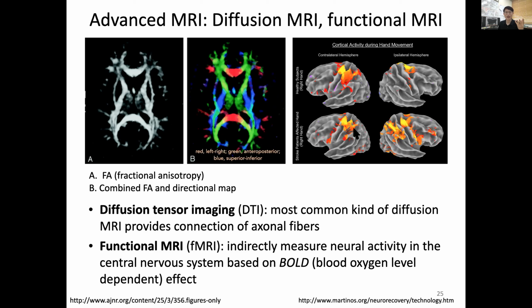So when you perform fMRI, it's not going to be just one time. It's going to be more like on, off, repeated multiple times so that the noise level is relatively canceled out while your signal will stand out so that you can create these images. Still, you can see a lot of noise, but it's a powerful and precious technique. And that basis we call the BOLD signal. You have to know this BOLD because the mechanism or principle of fMRI is based on the blood oxygen level dependent contrast. What do I mean by this? Blood, especially oxyhemoglobin, when the oxygen is released, deoxyhemoglobin has a difference in magnetic property. So we use that to create the contrast of MRI.